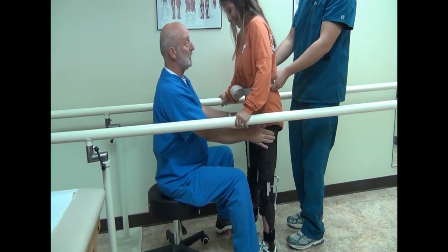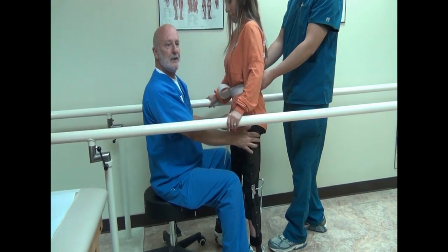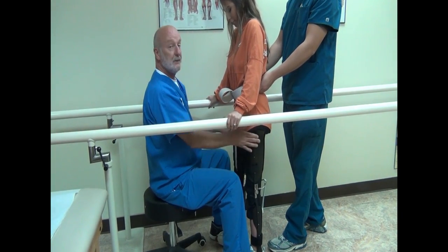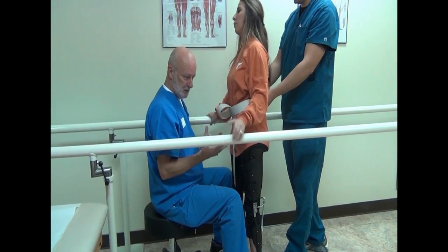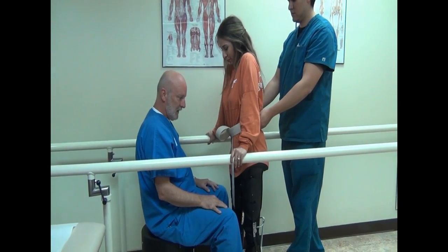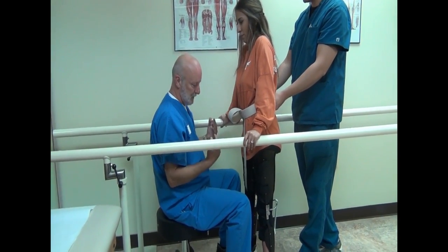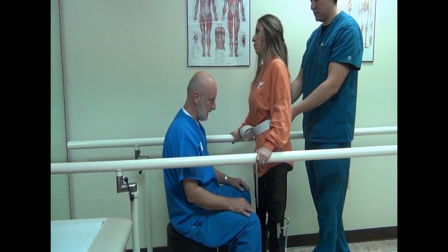But this is her first time walking in how long? Two and a half years. Wonderful. Although they did do some walking in therapy with immobilizers and had her up — she showed me a video. But this is a very good system — a great system, in my opinion. The best system for adults, because it's the lowest profile. There's no big pelvic section up here that really gets in the way and interferes with seating and is very difficult to put on, at least in my experience. I've done about 10 or 12 of these and every one has worked very well.